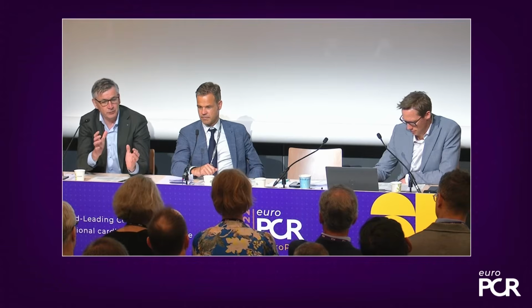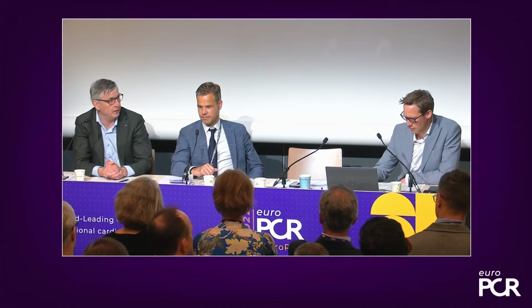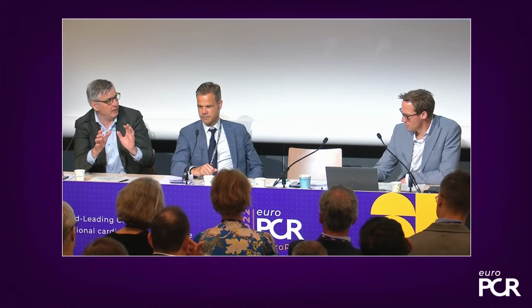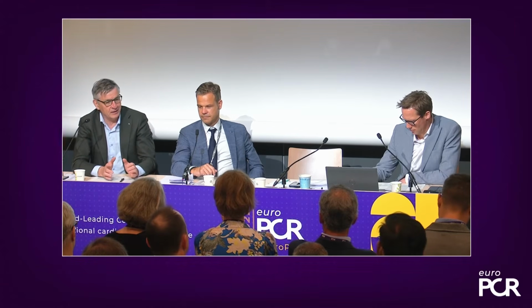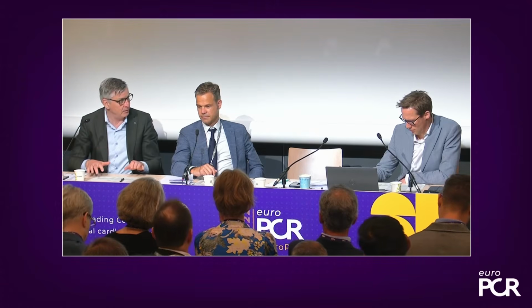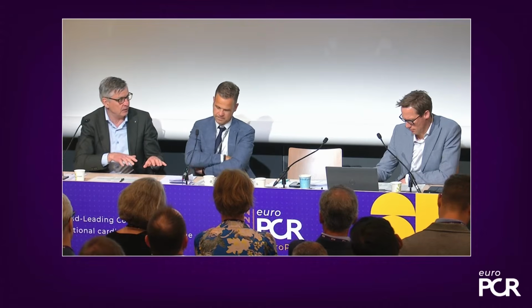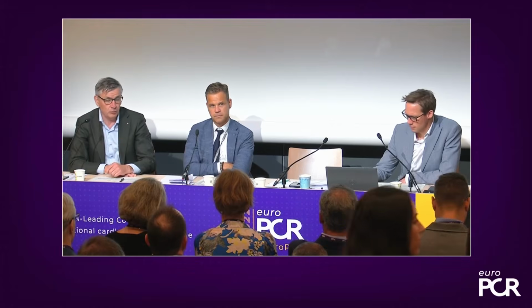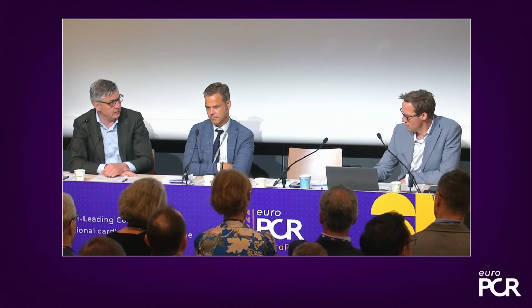The limitation is, of course, that when you look at the fluoroscopy, it's going to be dynamic. It's going to change according to the heart rhythm and to the patient's respiration, whereas the CT scan will be fixed on the table. And of course, you also need to have an idea that the patient is positioned on the table in the same way during the procedure as he was in the CT scan, so that he cannot be rotated to one side or the other. But again, as you saw here, we don't need to have it exactly to the millimeter. It gave us very nice guidance despite that.